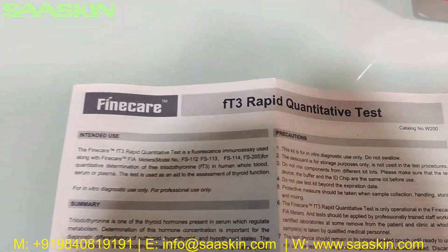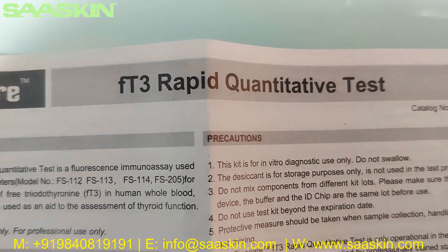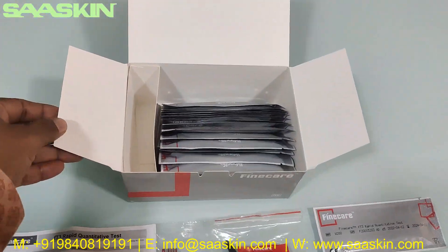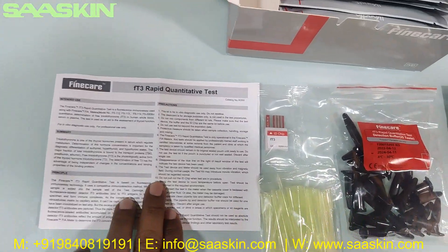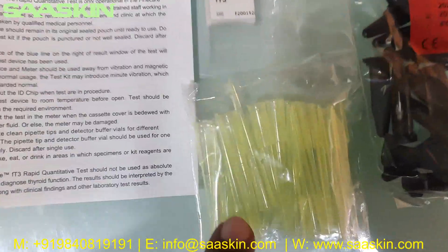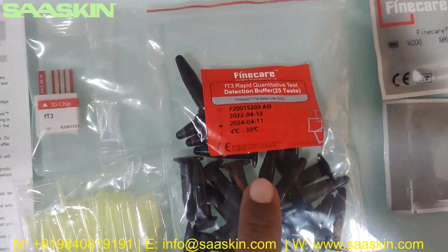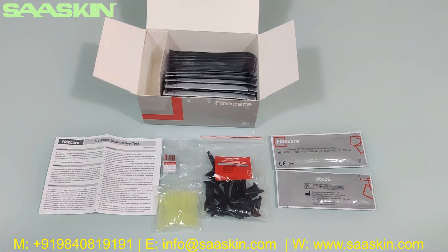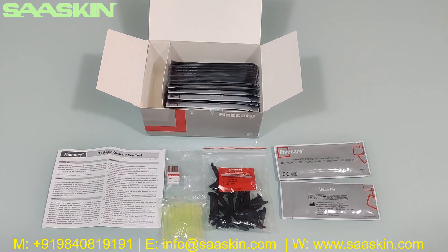In this 25-test kit pack you have: one instruction for use leaflet, one ID chip, 25 pipette tips, 25 detection buffers, and 25 test cartridges. This is a complete look at how the test kit looks.